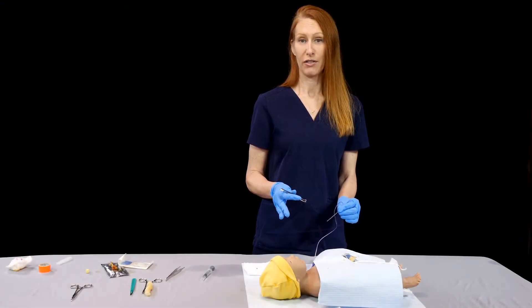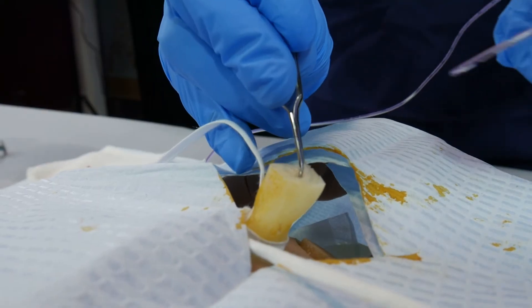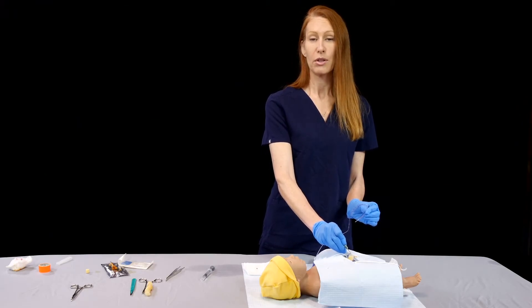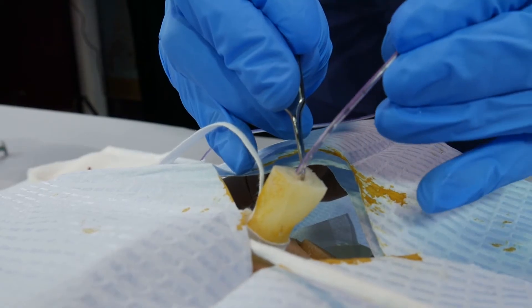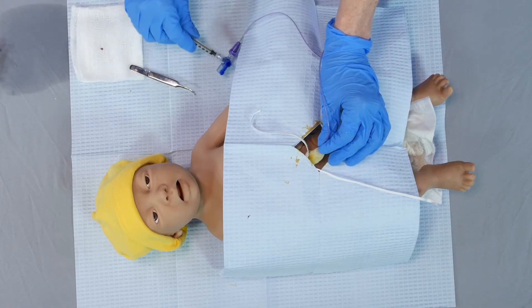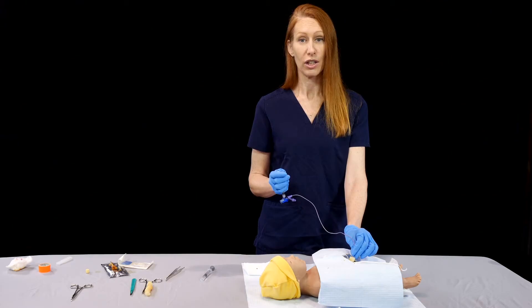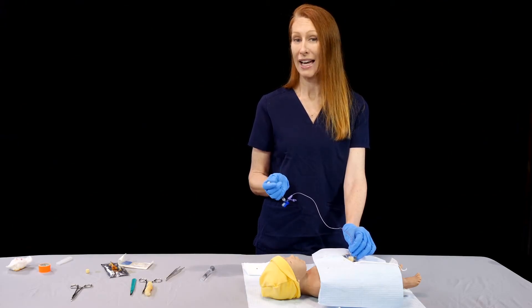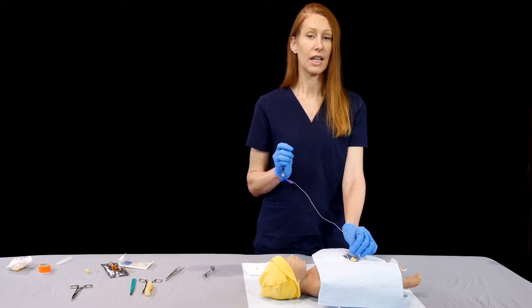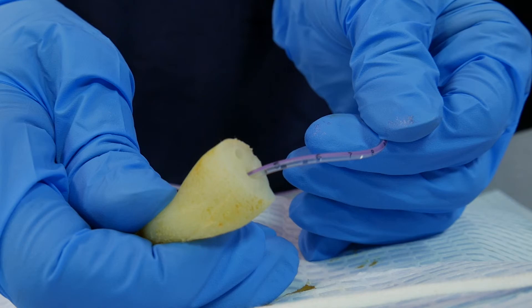You're going to insert the umbilical line into the umbilical vein. You can facilitate this by using your forceps to pull out on the vein and up on the umbilicus. You're going to need a second operator to assist — it's helpful to have somebody else pulling up on the umbilicus, and you also want to be able to withdraw as you insert. These umbilical lines are not checked by x-ray; these are emergent lines that we need to use right away. If inserted too far and it gets into the portal circulation, it can cause perforation, a clot with subsequent portal hypertension, or hepatic necrosis depending on what is infused. So withdraw as you insert, and once you get blood, insert the line about a centimeter more and then stop. It should not be in more than four to five centimeters to feel safe that you're not into the portal circulation.